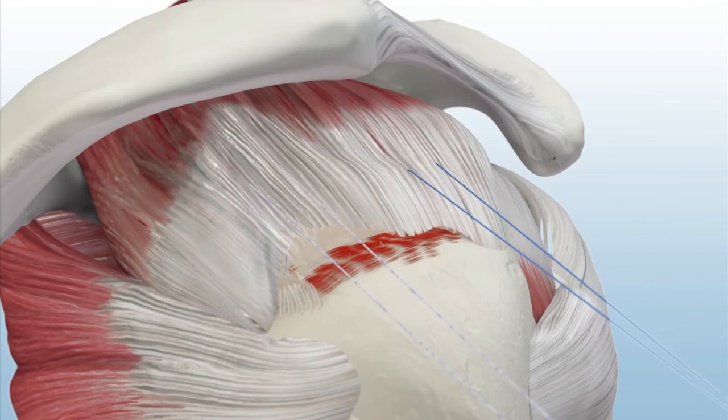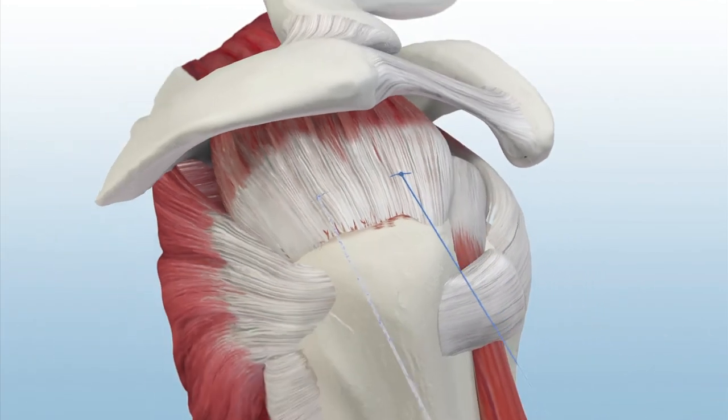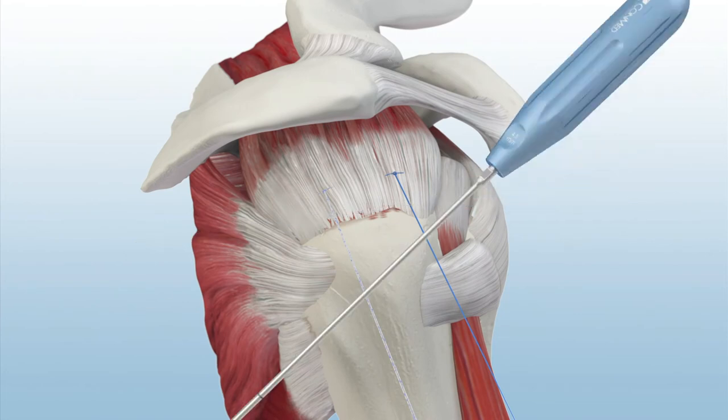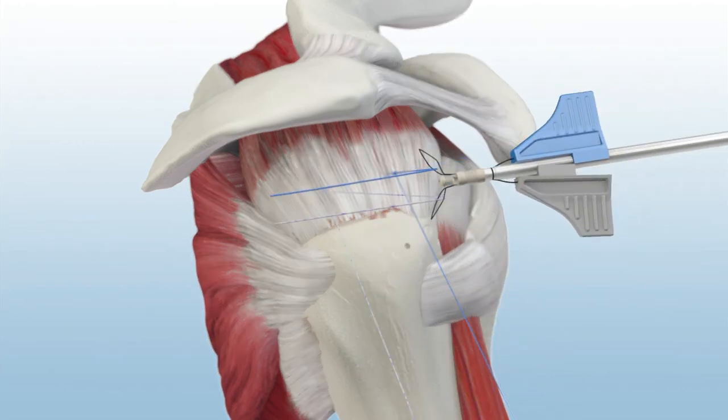Sliding knots are tied to secure the tendon to the medial footprint. A pop-lock punch is inserted down to the laser line. Two suture tails from the medial row are loaded into a 4.5 pop-lock knotless suture anchor.